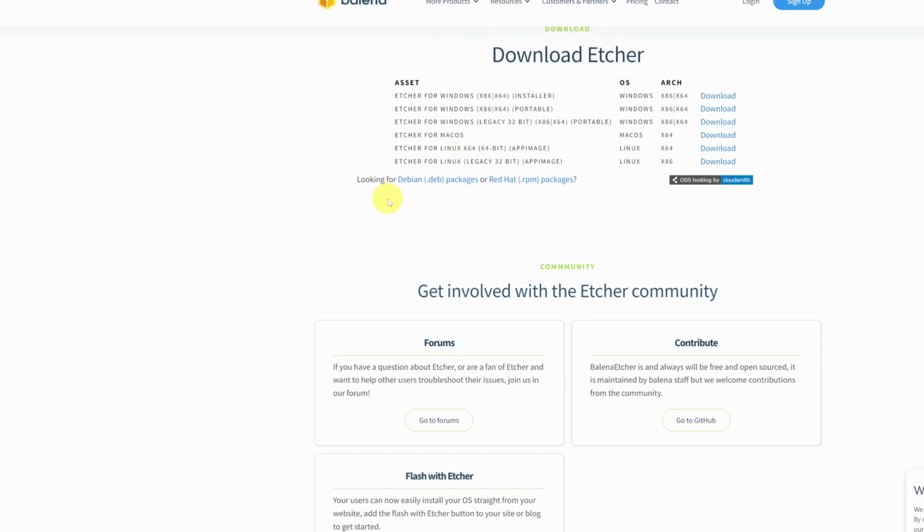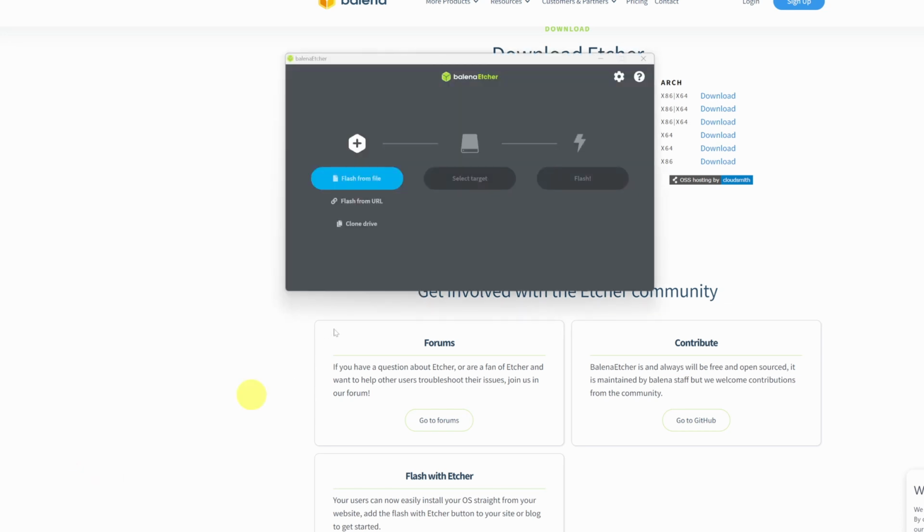I'll put the link to download the software. If you download and install the software, I'll show you what that looks like. This is what the software looks like. You will choose from a file, and you go into your PC to find that ISO file. You select the SD card, that you connect to USB of your computer, and you click flash, and then it'll write that ISO file to that SD card.